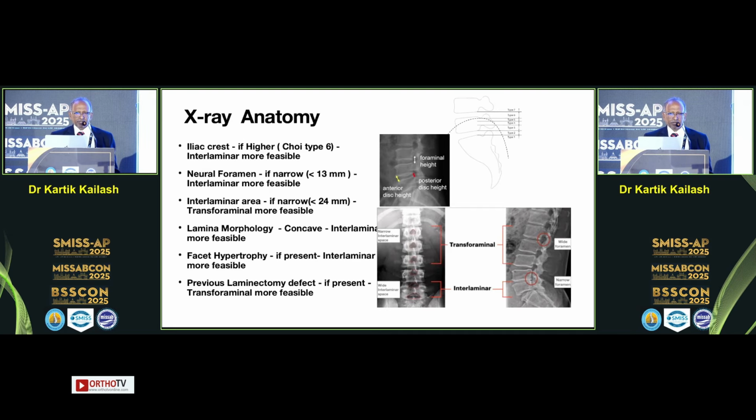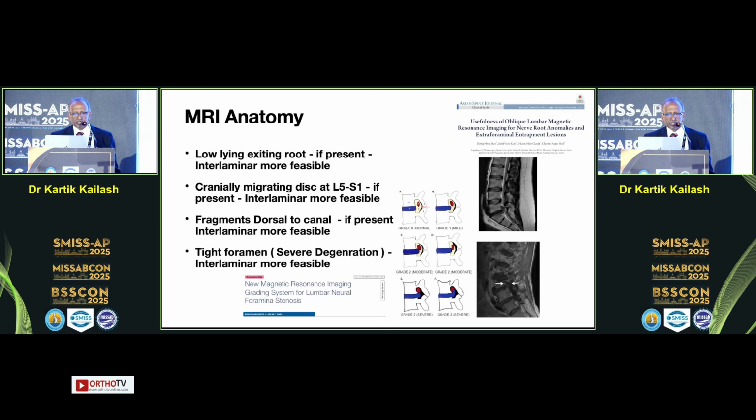Anatomically, the higher the iliac crest, the more difficult it is for transforaminal, so avoid it in the beginning unless you want to do a transiliac procedure. So if you have a previous laminectomy defect, transforaminal is much easier to approach as compared to an interlaminar technique.